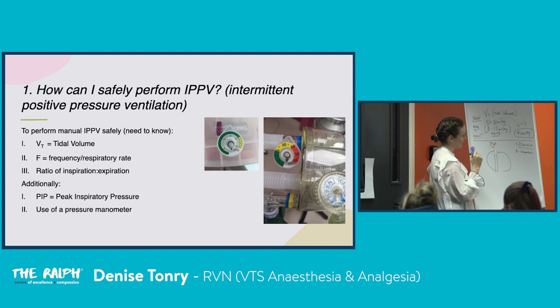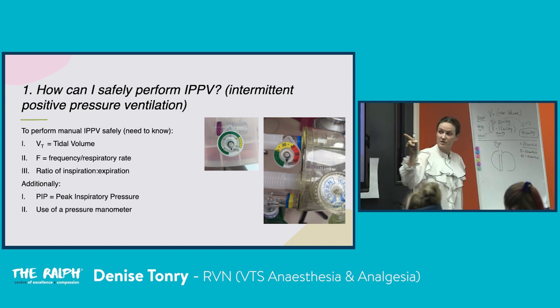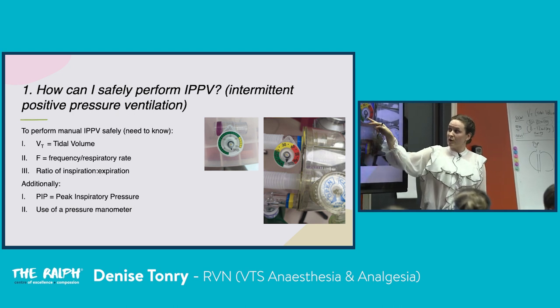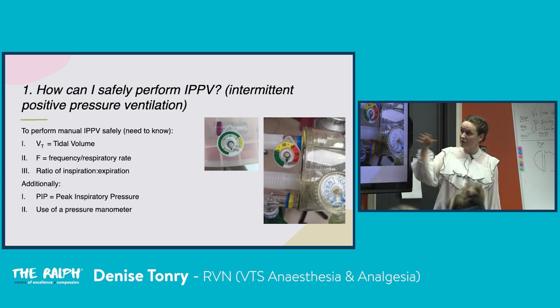Again, they're smaller, more delicate. And for dogs, anywhere from 10 to 15. I find I'm using these on these systems if I'm trying to induce apnea. Higher pressures generally overventilate, then hyperventilate the patient, drop the CO2 and drop the respiratory drive quicker. So you tend to use slightly higher pressures than you maybe would if you're ventilating them for 3 hours in a surgery. So these are very useful.